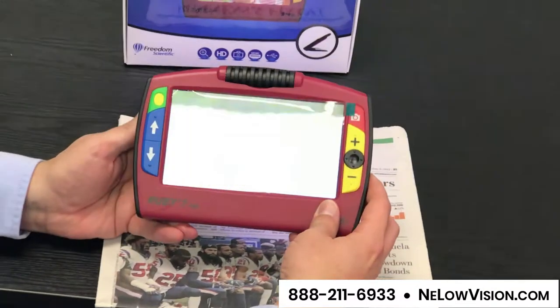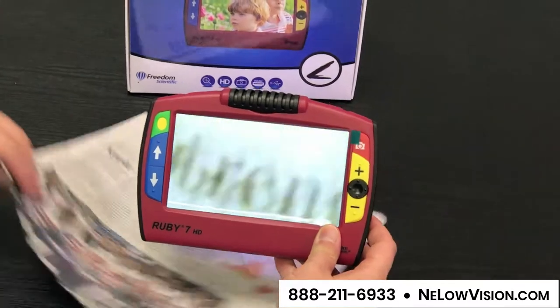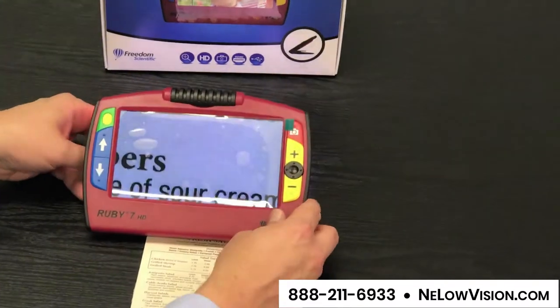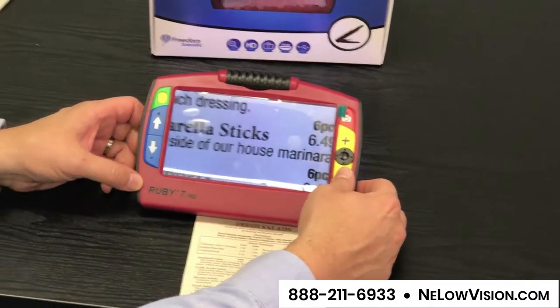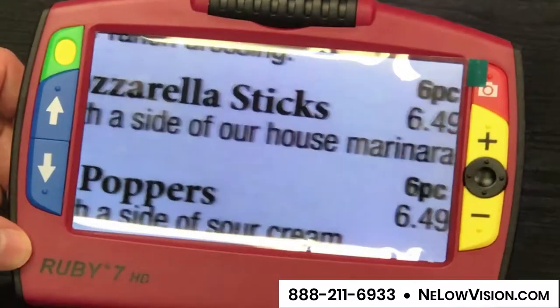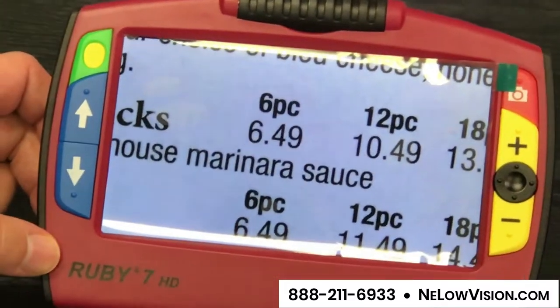One of the nice features is if you're going to be out and about — say you're at a restaurant — you can take this device and place it directly on top of the menu to get a sense of the price of fried mozzarella sticks, which are currently trading at $6.49.